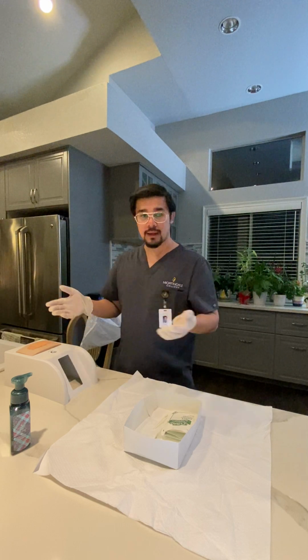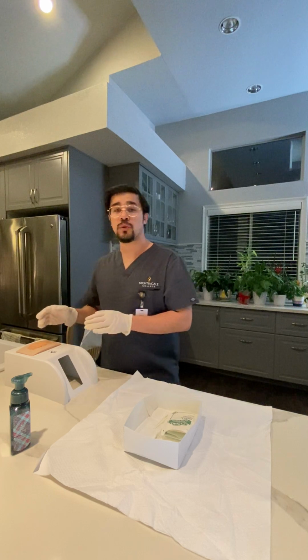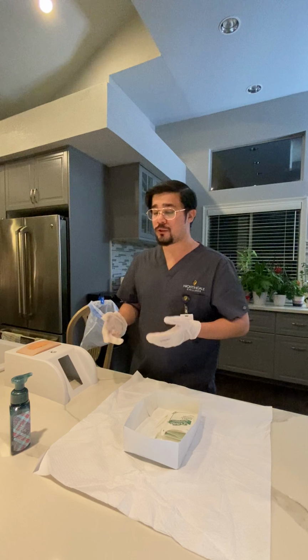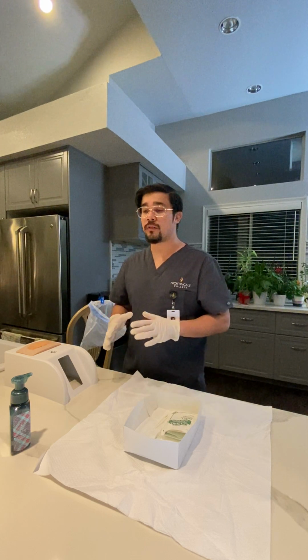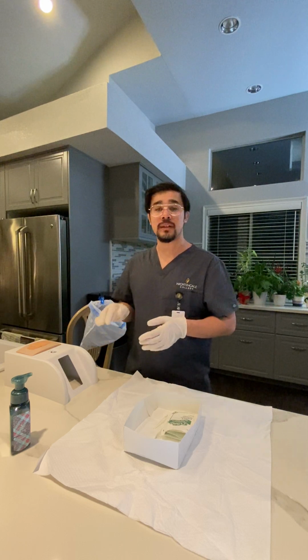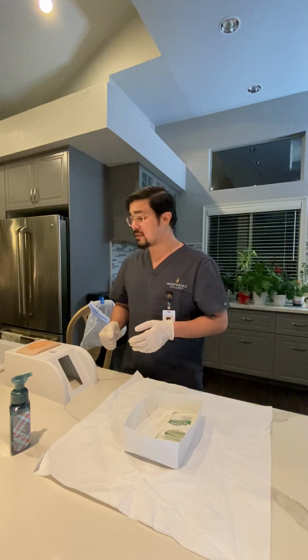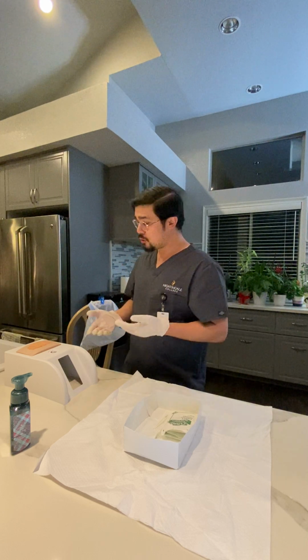So with that, I need to assess the patient's wound as I remove the bandage. And what I'm looking for is any potential discoloration, any odors, any type of drainage. And then after I remove it, I can palpate for any edema, seeing if there's any pitting or any sign of infection that the wound may potentially show.